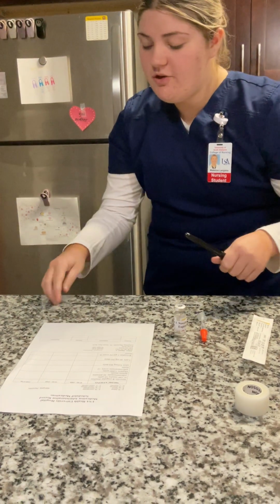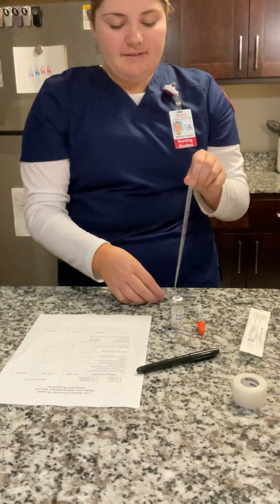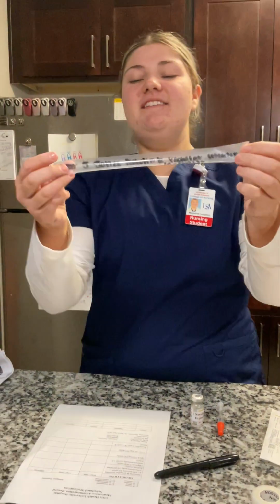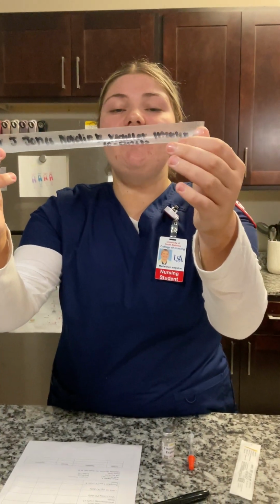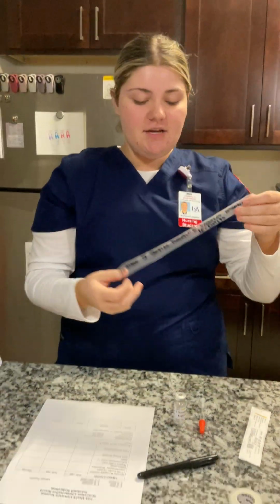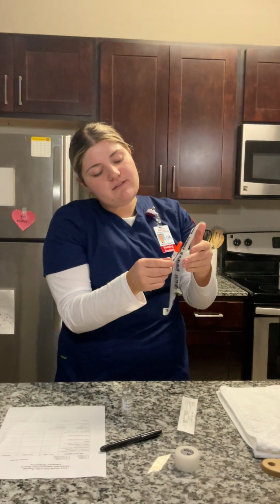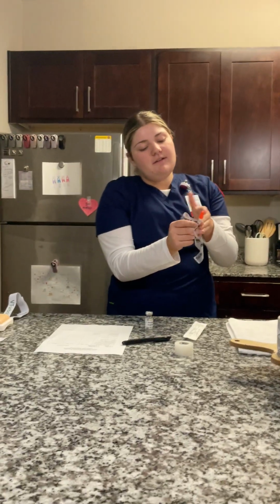And now I'm going to show you my label. See, really big handwriting. So you can see that it does say Jaguar J. Jones, the name of his medication, which is Novolin R regular insulin, and the dose, which is 10 units. So now I will place this on my syringe, but in a spot where I'm still able to see the 10 units that I have in the syringe.